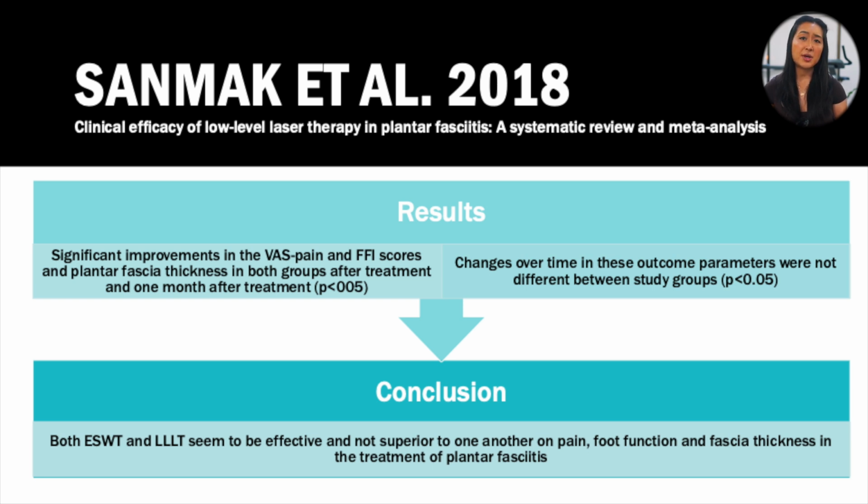As a physical therapist, when I read the study, the main thing that did jump out at me, as I have previously spoken to you about, is the dosages required for clinical efficacy. They administered shockwave therapy a total of 3 times once a week and laser therapy a total of 12 times every other day to get similar results.